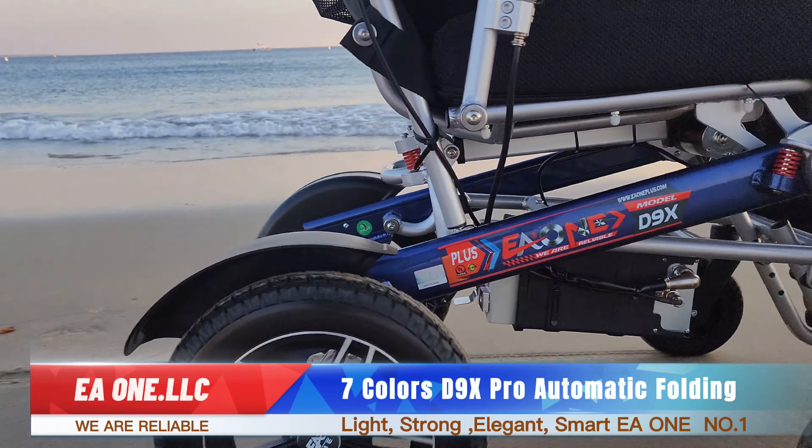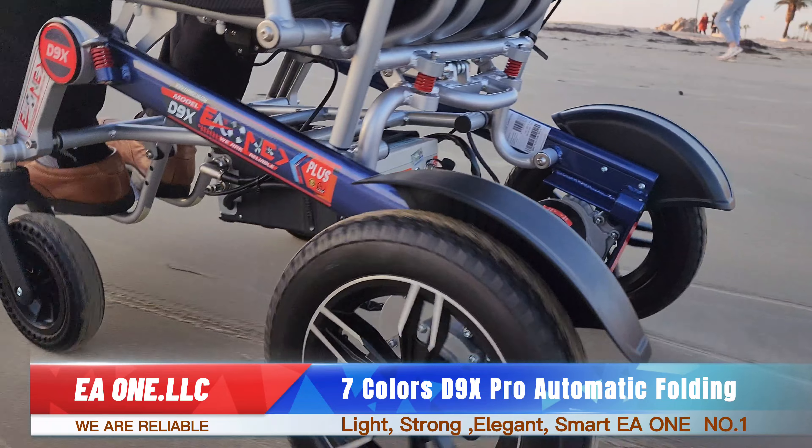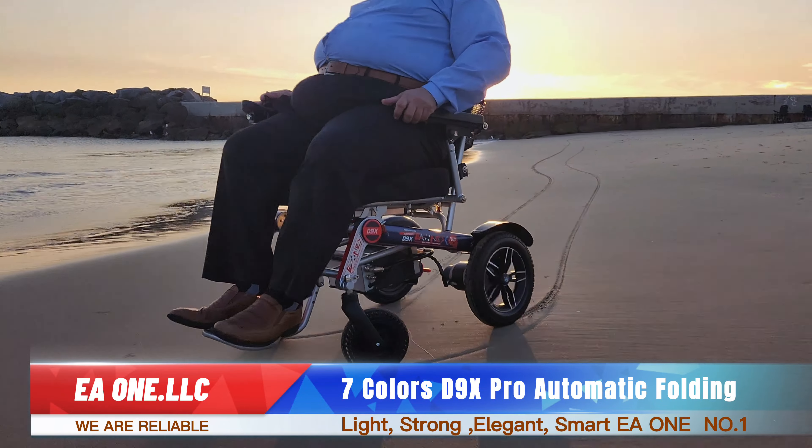Seven colors, D9X Pro, Automatic Folding. EA1 LLC — we are reliable, light, strong, elegant, smart. EA1 number one.